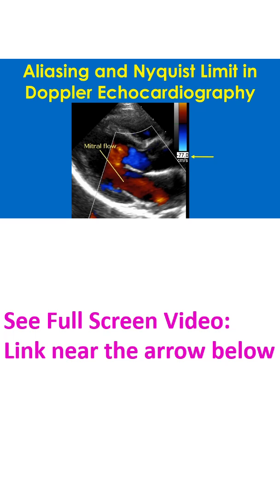The Nyquist limit of the color Doppler is displayed at the upper and lower ends of the color bar, which may be displayed either on the right upper corner or left upper corner. Here, the flow away from the transducer in blue color has a Nyquist limit of minus 77 cm per second. The Nyquist limit for the flow towards the transducer is not seen in this image, as it has been cropped below that level.